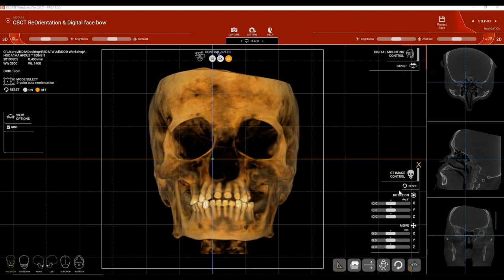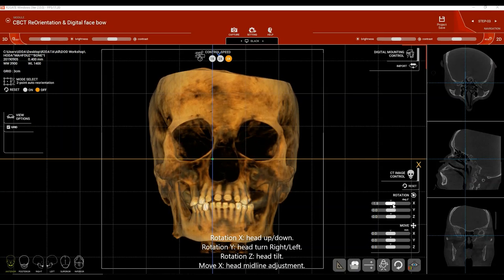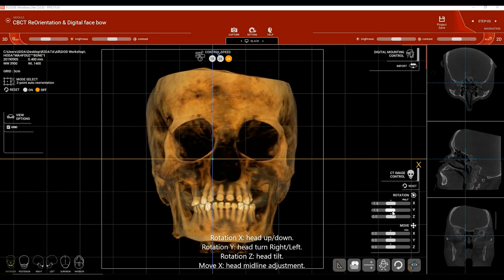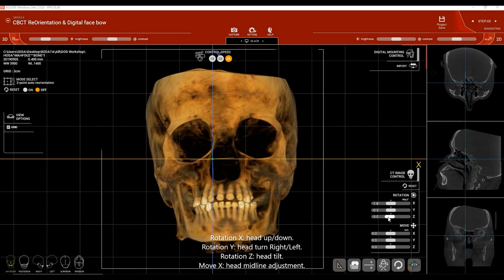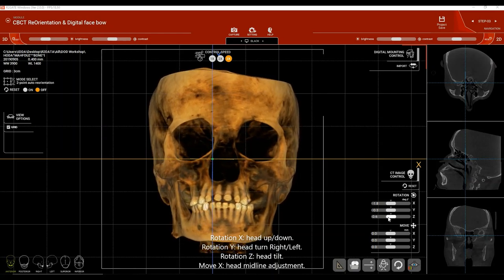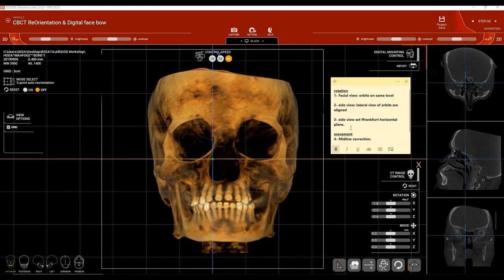In the CT image control you'll find Rotation and Movement. Rotation has X, Y, and Z; Movement also has X, Y, and Z axes. X moves the patient's head up and down, Y moves the patient's head side to side, and Z tilts the patient's head to the right and to the left. Move shifts the whole CBCT image to one side or the other.